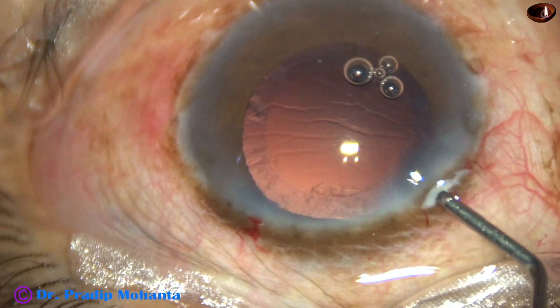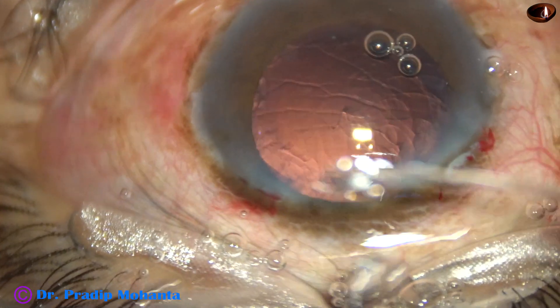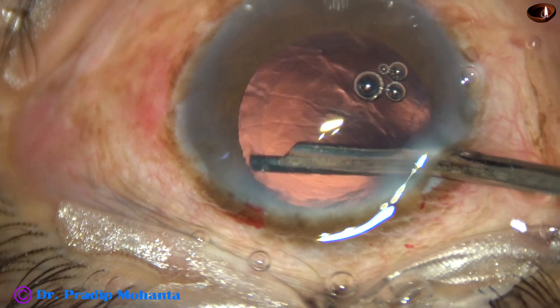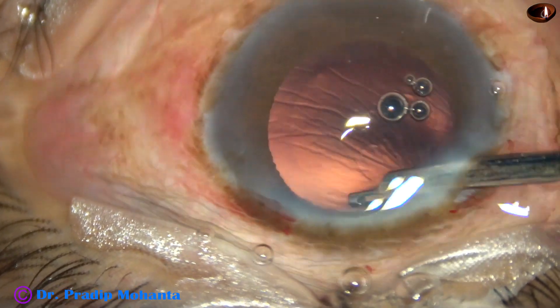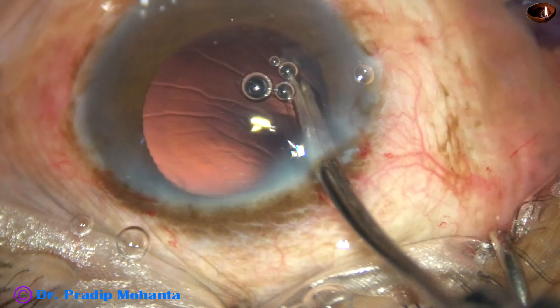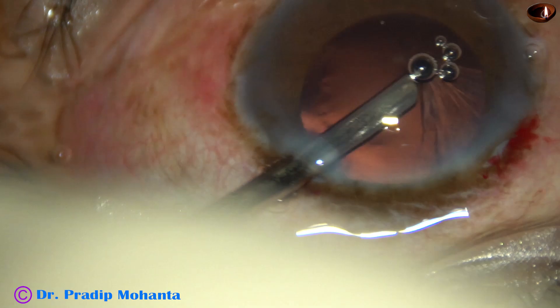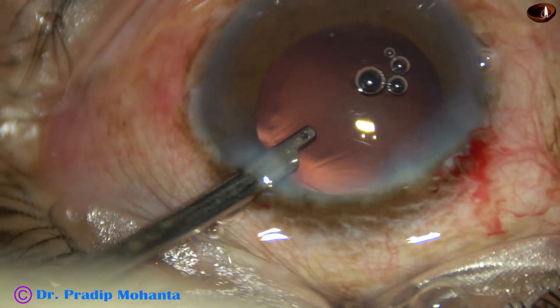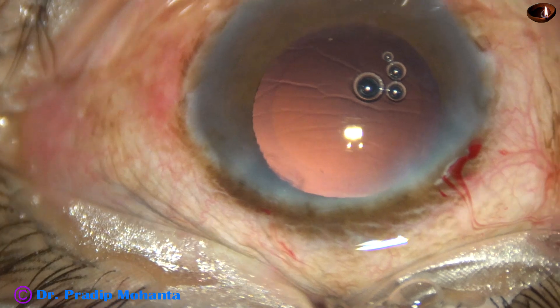Some more viscoelastic — 2% HPMC — is injected into the anterior chamber. This is a 23-gauge Simcoe. With the help of this Simcoe, the cortex is being removed. Most of the cortex, except the cortex in the sub-incisional area, has been removed. In this case there is only one sideport, so I did not use bimanual technique. The sideport is not very big — about 1.6 to 1.7 mm — but the 23-gauge Simcoe can go through it.